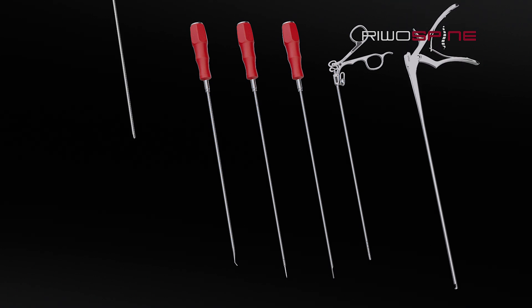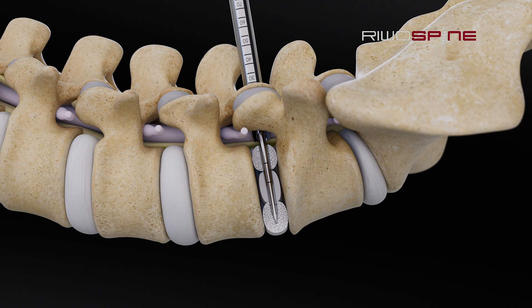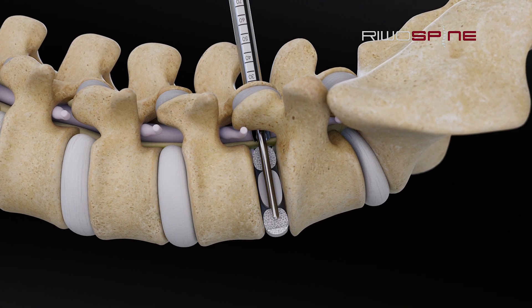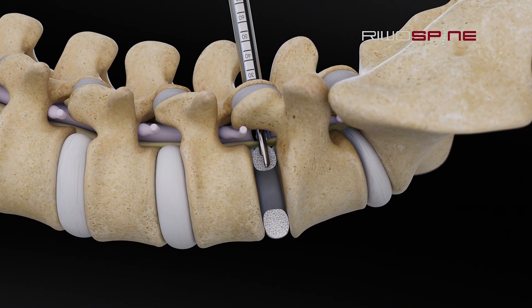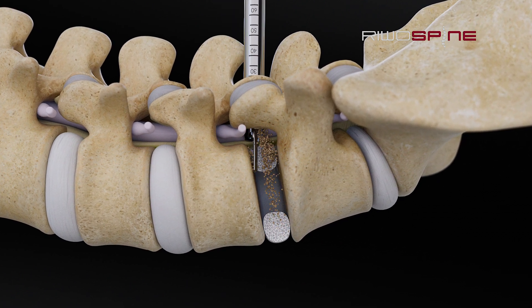For example, a nucleus resector is used for efficient and fast disc removal. Osteotome and curved raspitorium will help to remove the main disc tissue. Then a nucleus resector can be used to clean the disc space from the rest of disc tissue. Rasps should be used to prepare the endplates before the cage placement.